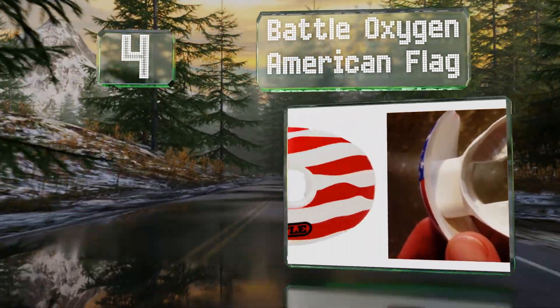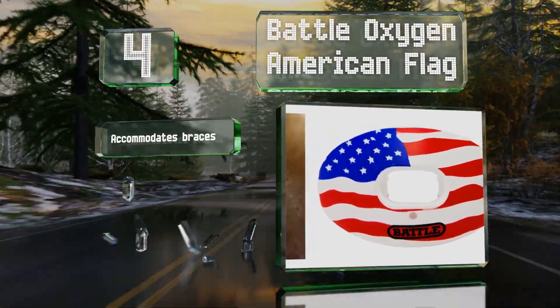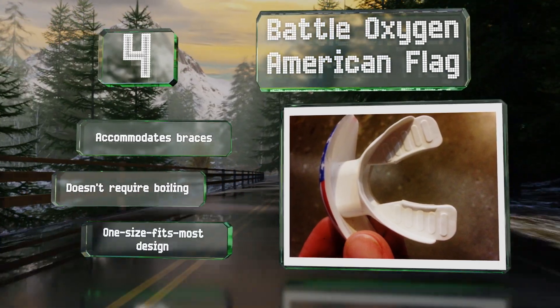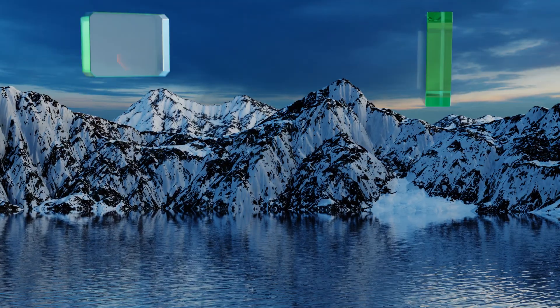At number four, the Battle Oxygen American Flag features a large central opening for airflow that shouldn't hinder your breathing, making it ideal for intense activities like MMA and boxing. It also allows you to show off your patriotism. It accommodates braces and doesn't require boiling. It's a one-size-fits-most design.